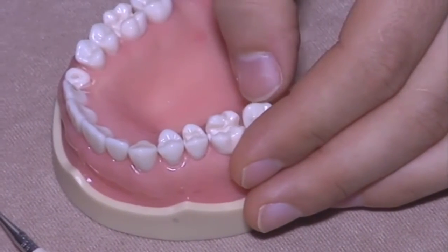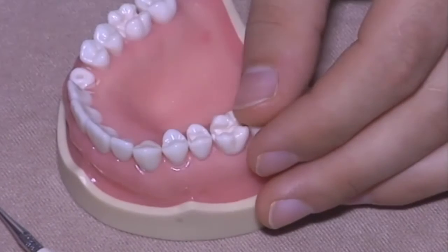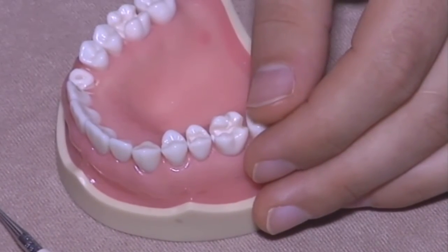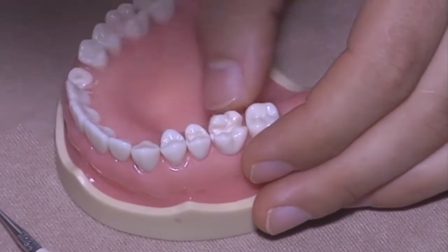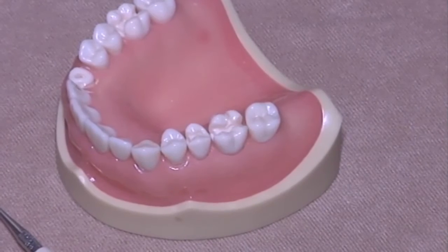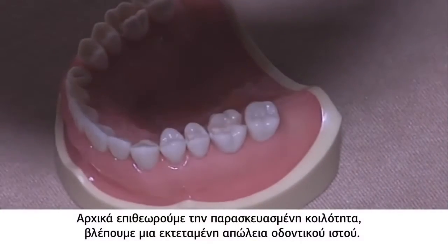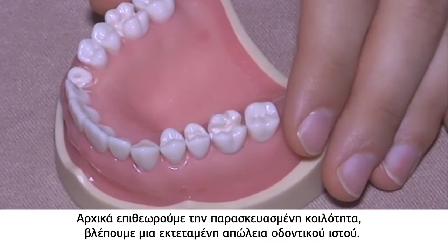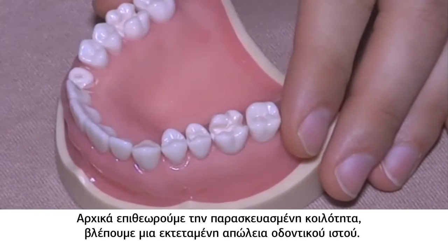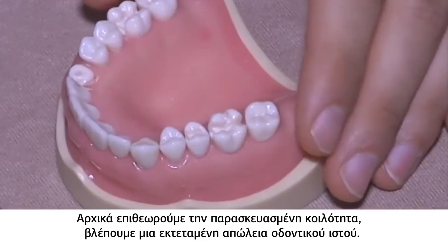The layering is anyway the same, so layer by layer we're gonna build up the restoration, but with the same classic color. And you're gonna see at the end that the difference in color will not be as big as you could expect, because it's not as in anterior teeth that the light passes through. In posterior teeth, the light cannot pass through because there is always tooth there.